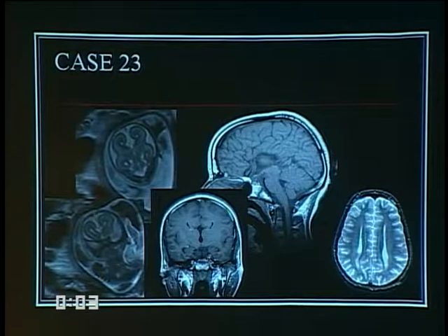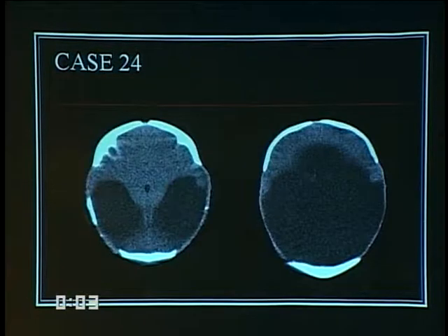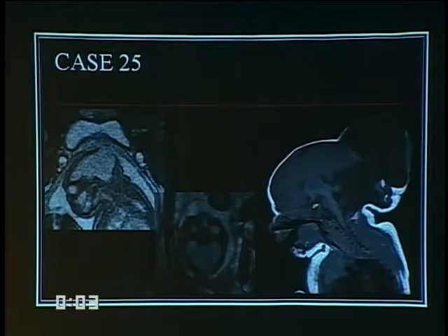We have fetal diagnosis and postnatal. I showed you a fetus with this diagnosis earlier. This I couldn't resist putting in.